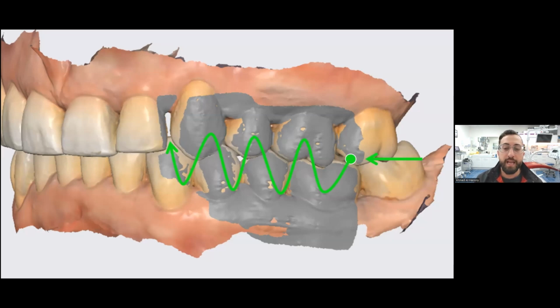As you move forward, you may notice the software brings the teeth together. One key tip is that I would give it a little bit more data. I usually like to bite scan 4 or 5 teeth, so typically up to the canine. And it's really quick, guys, you shouldn't be spending more than 5-10 seconds on this. On the other hand, not only should you give it more data, I don't think you should give it too much.